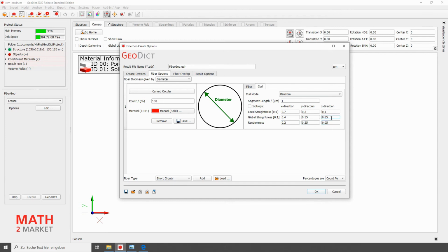As we can see from the values, we want the fibers to remain very much in the xy plane and not have a large curvature outside of it. Also, we want to have more curves in the y direction, and in the x follow the direction of the current fiber direction.